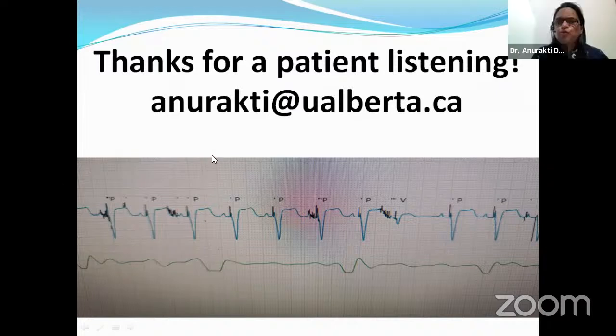Dr. Abhilipsha is asking, with an HRV 24-hour protocol, how do you define the day and the night period? Usually it's an 18-hour recording which we have in heart rate variability, which includes night. I don't understand the question very well, because you will always see the time on the Holter recording. According to the time, you can see the variability happening during the night and day as well. It's a total variability which we are calculating, which should be more than 100. It accounts for the sleep and the night period as well. It's an 18-hour period and we are calculating according to that.